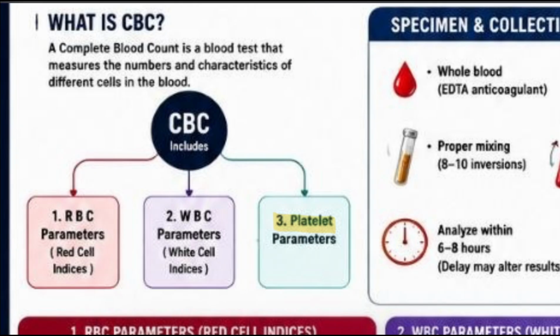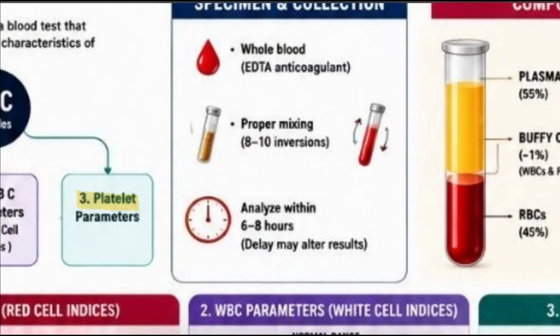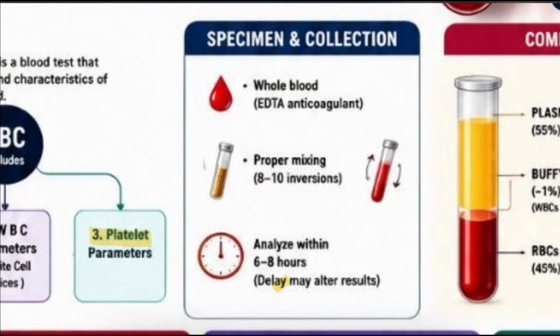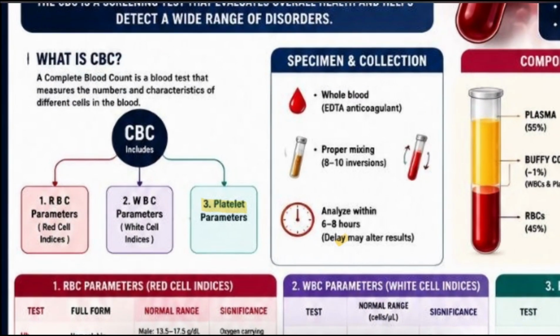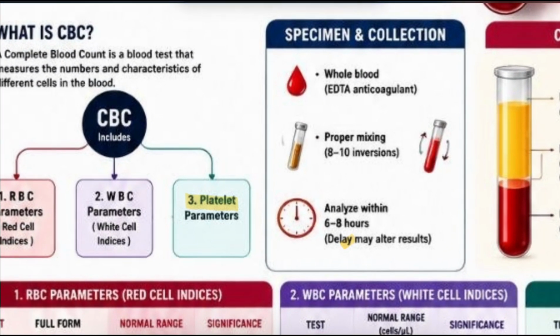Okay, whenever you are collecting a CBC, we have to use a purple top tube.